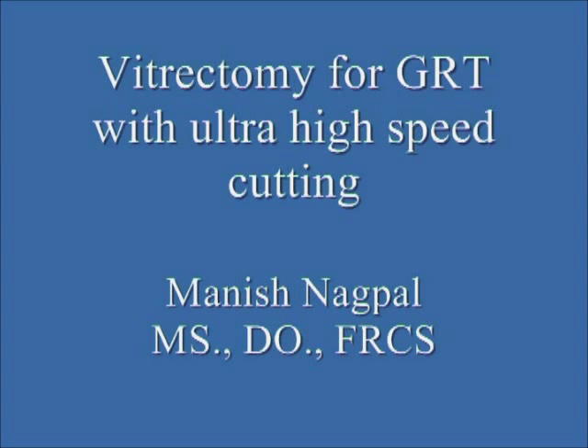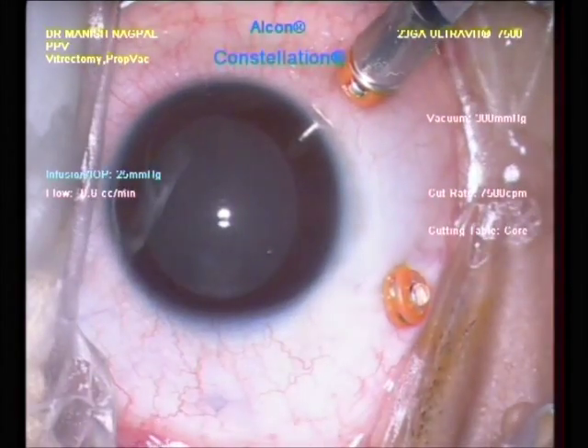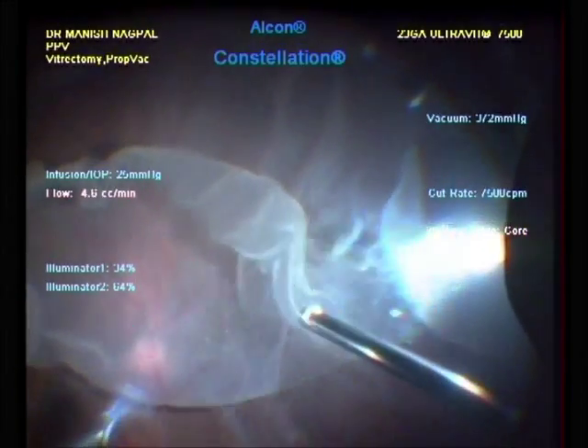This is a case of giant retinal tear being operated using the ultra high speed cutter at 7500 cut rate. 23 gauge valve cannulas are inserted along with a 25 gauge chandelier light source.